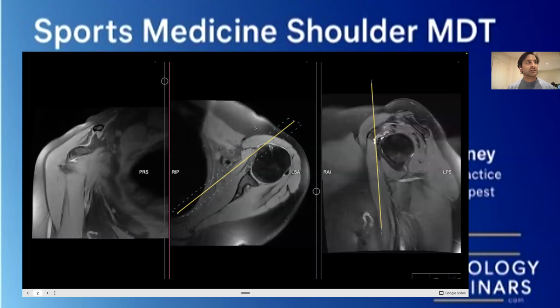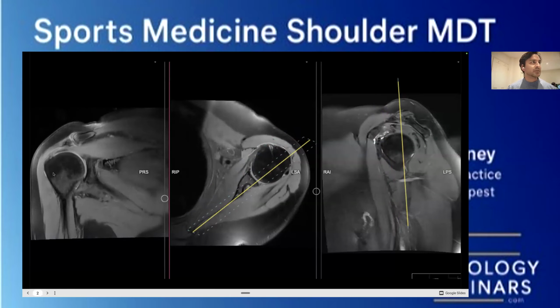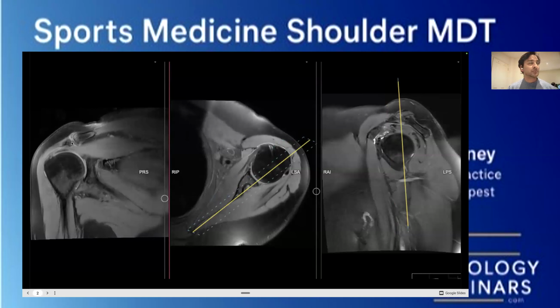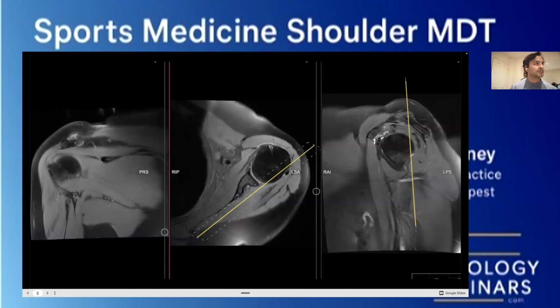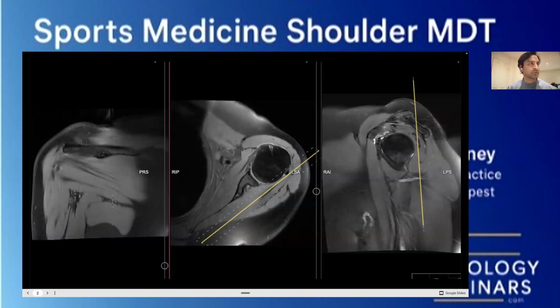Now we're going to go to the next view, and that's going to be looking straight on at the person, and we're kind of walking through this person's body. And now what we can see is a humeral head that's sitting over here. We can see the glenohumeral joint where everything attaches. We're going to see the AC joint all over again. And also we can see this stuff over here and this stuff over here, and that's your muscles. And so what you can see here is that the muscles and tendons are now being seen from a slightly different point of view.